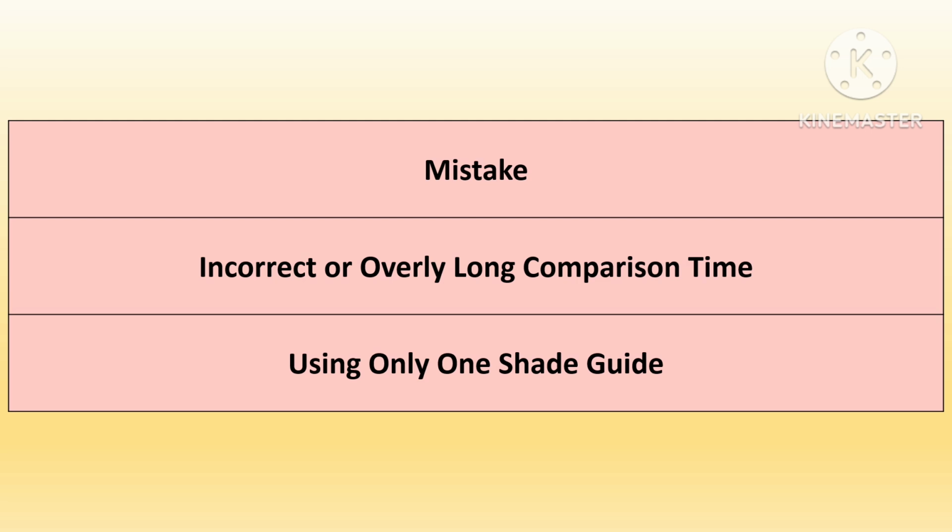Relying on only one shade guide to choose a color may not cover the entire range of possible tooth shades. Use at least two different shade guides to ensure a broader range of shades, especially when dealing with a unique or hard to match tooth color.